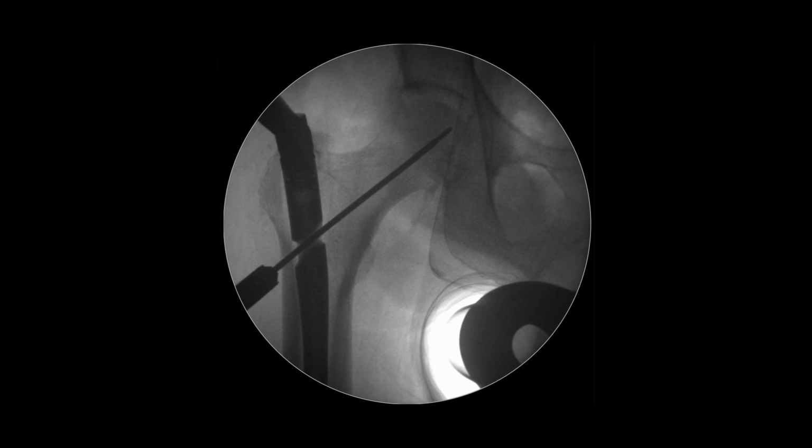We then check the lateral view once more. Even though the one-shot device was used, the nail rotation may change during insertion of the guide wire. Therefore, we need to check that we're definitely in the middle of the femoral head, also in the lateral view.